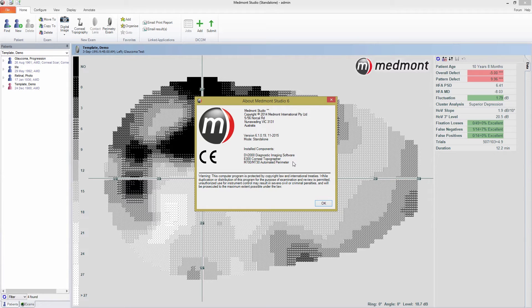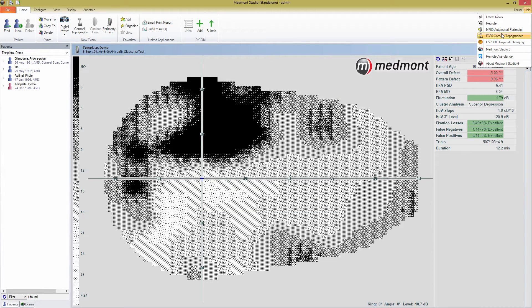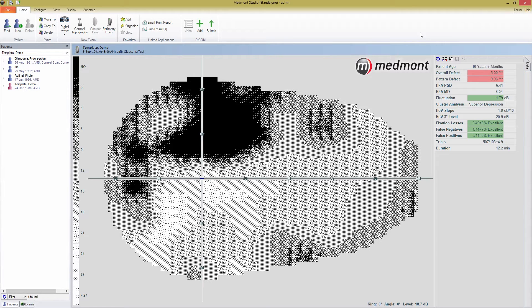You can also access all of the user menus for your installed Medmont instruments from this help menu. If you don't have an M700 installed, you're going to want to open the Medmont Studio configuration tool, which can be found in your Programs list, and reinstall Medmont Studio with the M700 component selected.